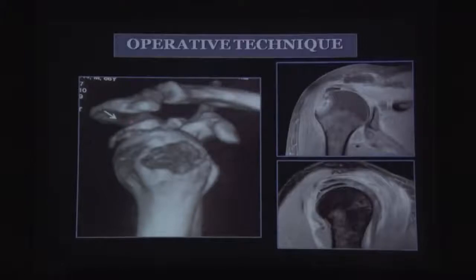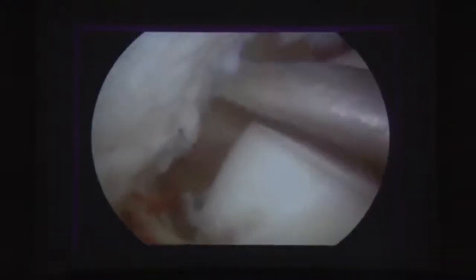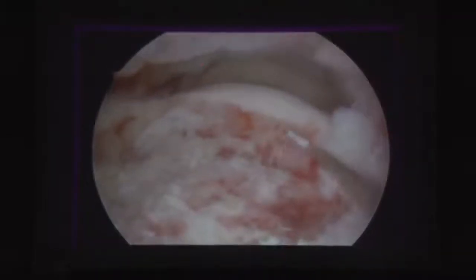Here is one such patient showing a greater tuberosity avulsion fracture sitting in the subacromial space, with the crater and the retracted portion visible. The cuff is always attached to that piece. Looking through the posterolateral portal you can see the crater and the fragment. Most of these will have some partial cuff tear fraying, so the first step is debridement, then identify the crater's medial-most and lateral-most parts.